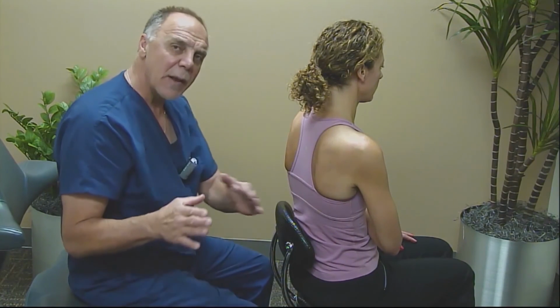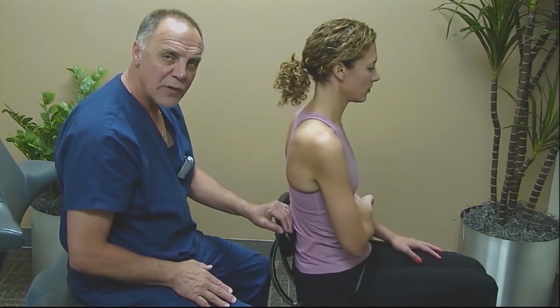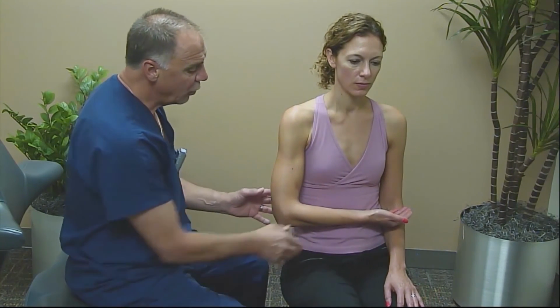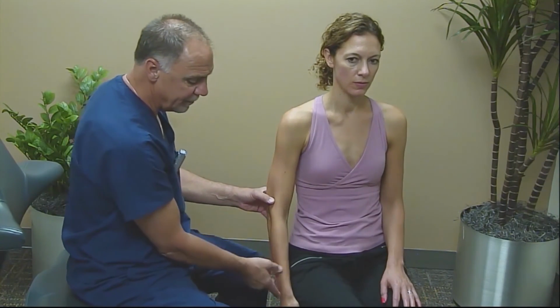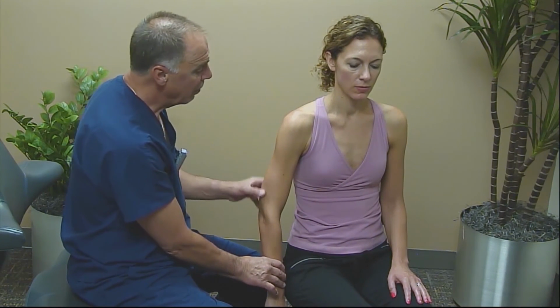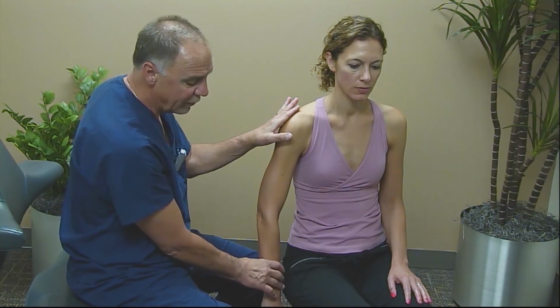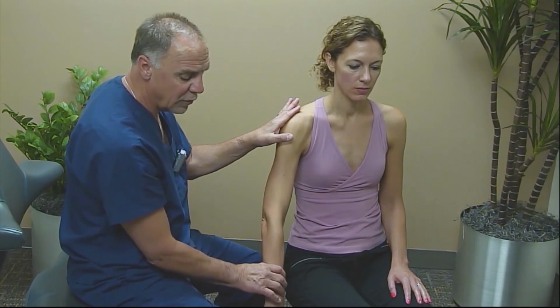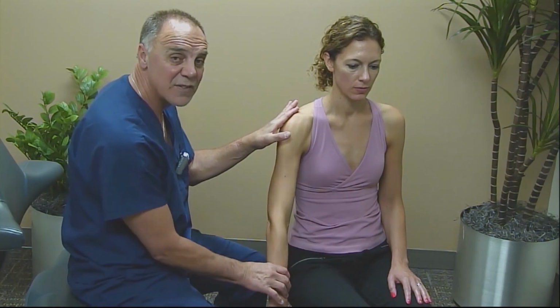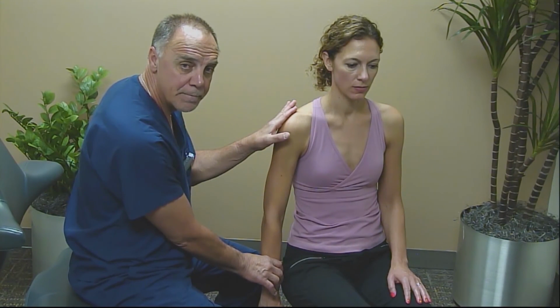Now, the last thing, depending on how you'd like to do your examination, we do a couple of dynamic maneuvers looking at the supraspinatus tendon as well. And this one is we drop the arm along the side, we rotate the thumb in, placing the transducer on top of the lateral edge of the acromion. We ask the patient to abduct their arm about 30 degrees and up and down, and we're watching for the slide of the supraspinatus tendon underneath the acromion.